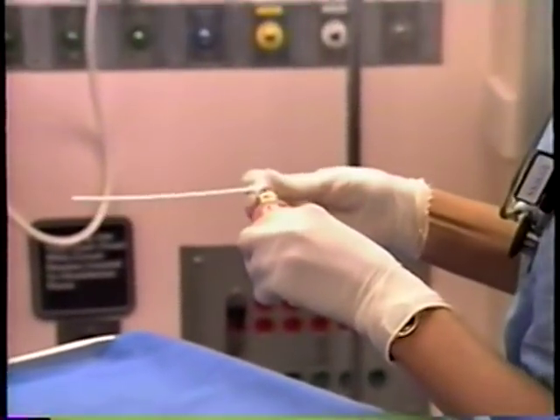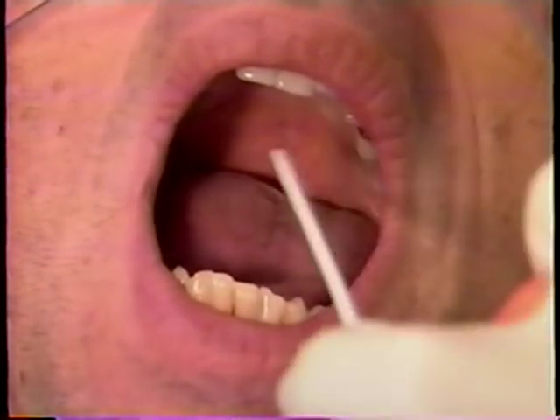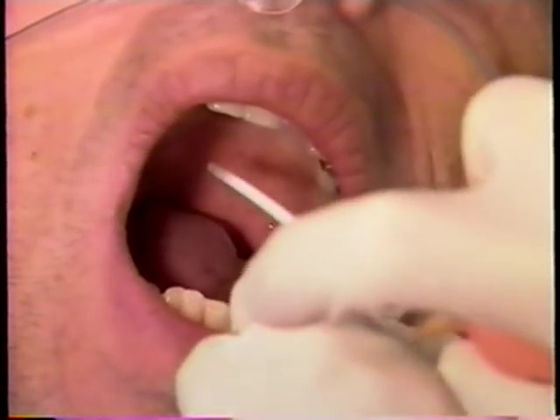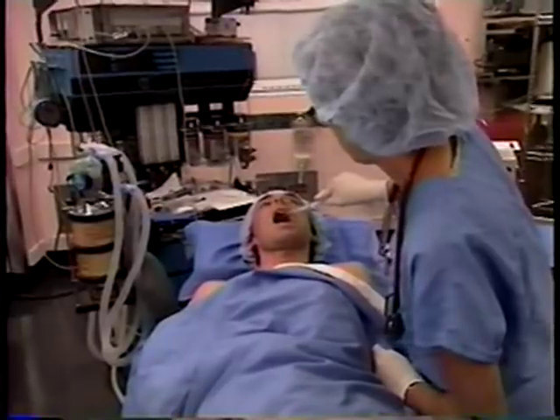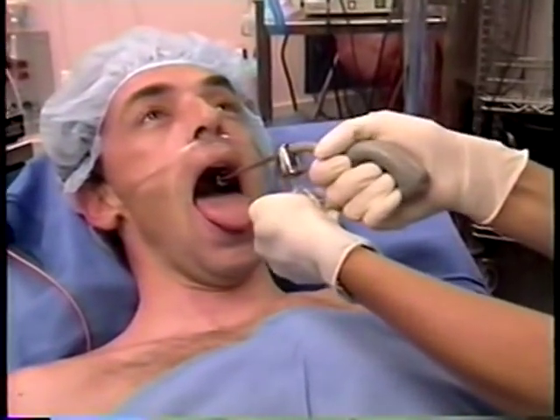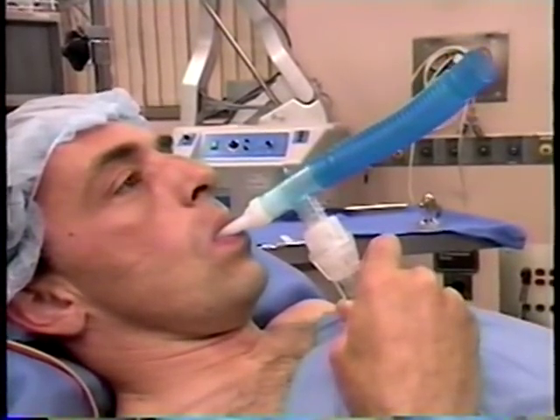Oral sprays employing a long, flexible cannula make it possible to deliver topical anesthetic agents — here 10% lidocaine spray — to the oropharynx. Each spray delivers 10 milligrams of lidocaine with an onset time of 2 to 5 minutes. Adequacy of anesthesia can be tested by depressing the back of the tongue with a tongue blade. If a patient can tolerate this, the cannula can be inserted farther into the posterior region of the pharynx. Any residual agents should be suctioned to reduce GI absorption and provide a clear fiber optic field. Other techniques include an atomizer containing 4% lidocaine or ultrasonic nebulization of 4 ml of 4% lidocaine over 10 to 20 minutes.